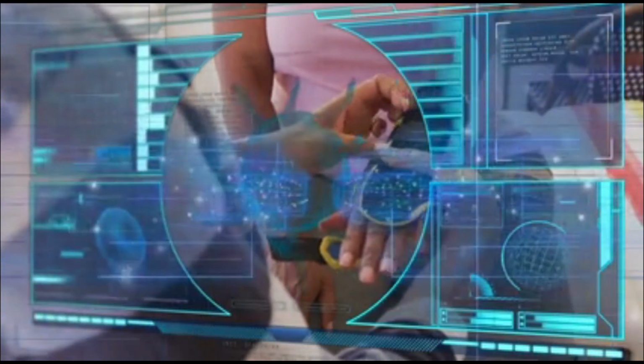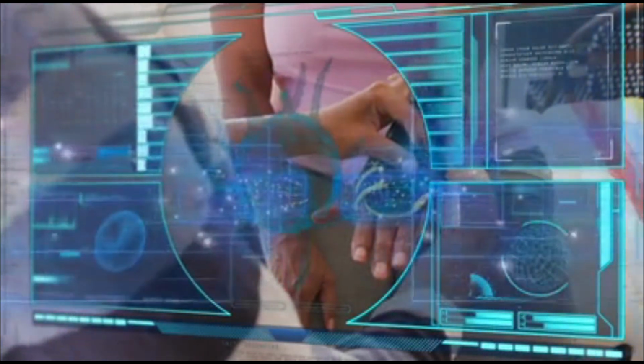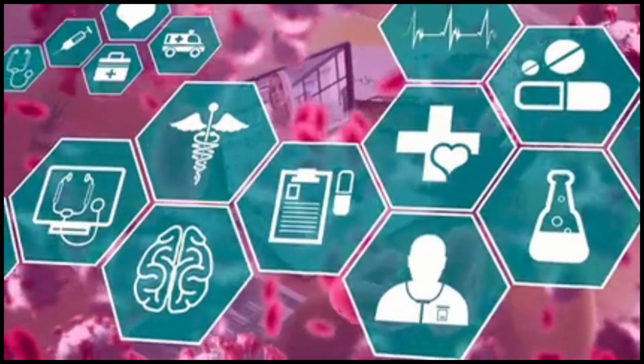There's a new technology, well, newish, I guess the past year and a half, 2 years, that helps remove plaque and calcium from your arteries. Initially, this technology was used back in the 80s and 90s to remove kidney stones. And in recent years, it's been revamped to remove the calcium from your arteries. It's kind of like plumbing the arteries, removing cholesterol and fat that builds up along the wall of the arteries. So where the heart, it causes the heart not to get enough blood.